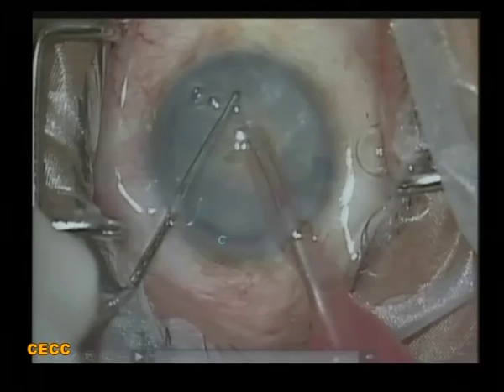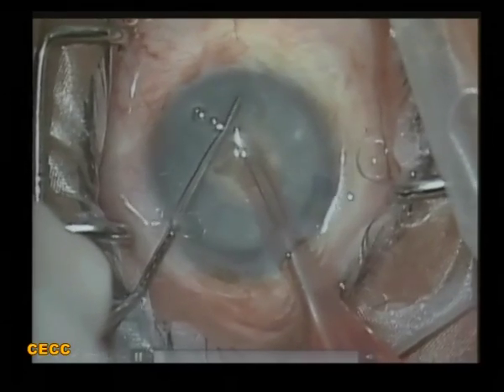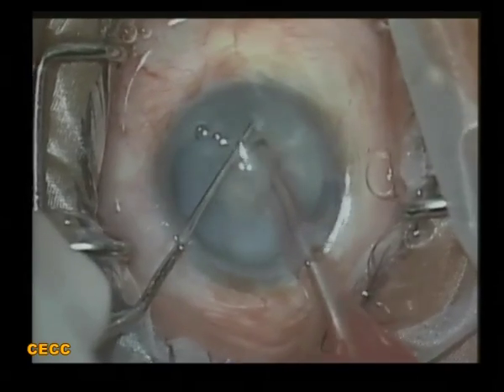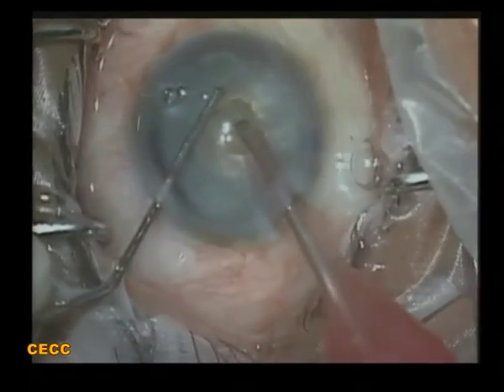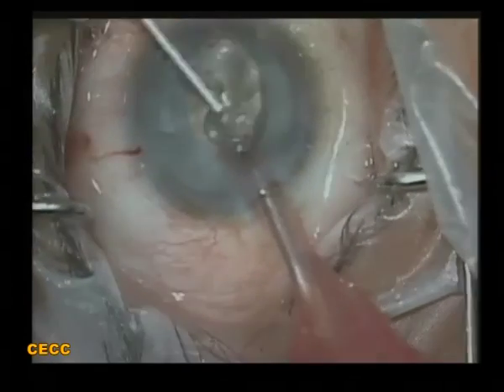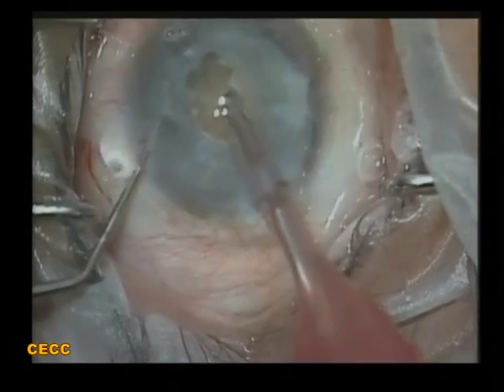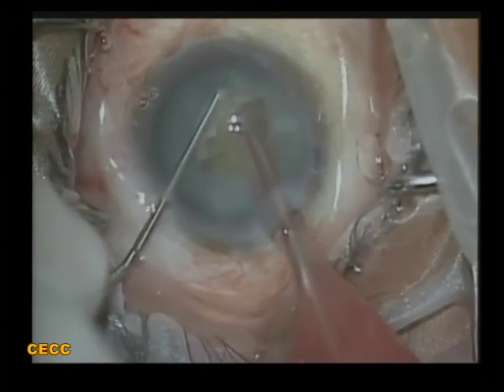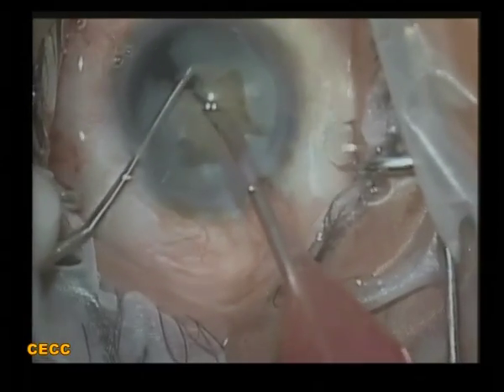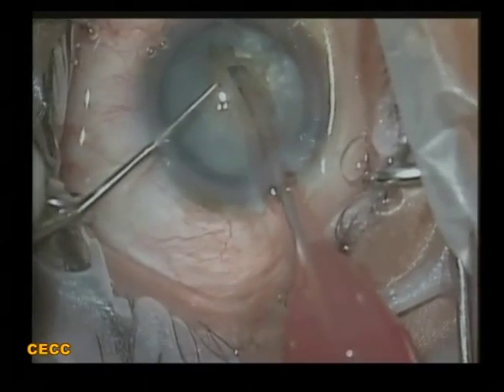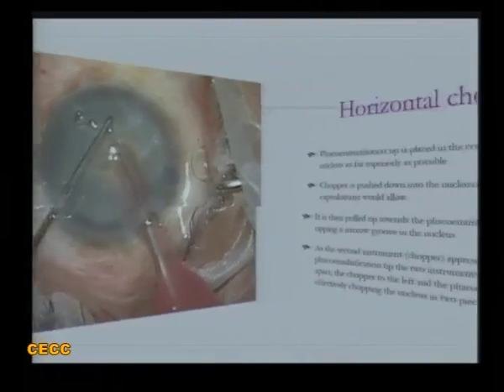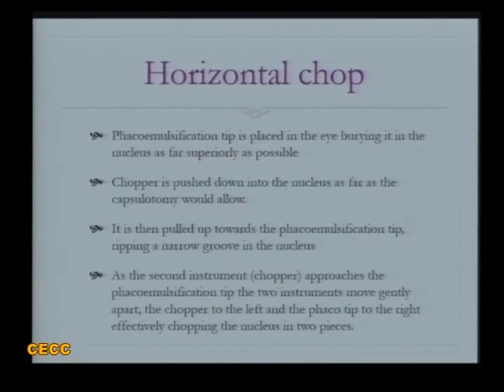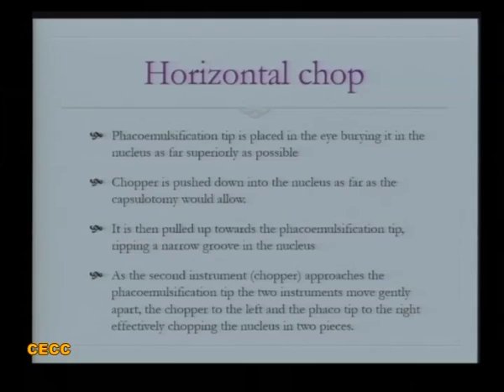In a white cataract case, a small capsulorrhexis was planned in two stages. I had already impaled the nucleus properly but there was still no chop — the nucleus was not rotating either, meaning it was not being properly divided. I realized the chopper was not appropriate. You need to create your own set of instruments — your own chopper and rhexis forceps. With a slightly sharper and longer chopper, the chopping was immediately a piece of cake. Know your instruments and machine parameters. In horizontal chop, the chopper plays a key role especially with a hard nucleus — it must cut through to the equator to give an effective chop.